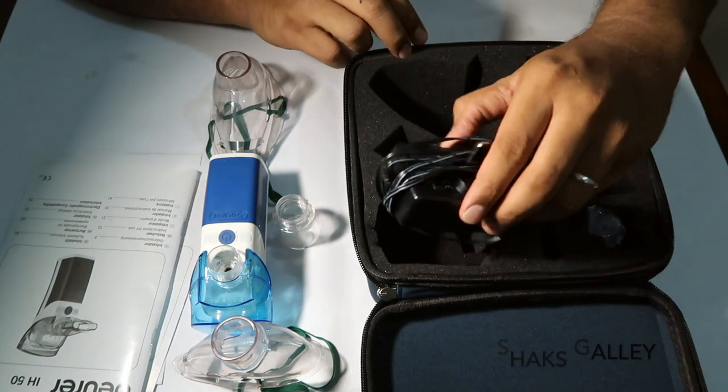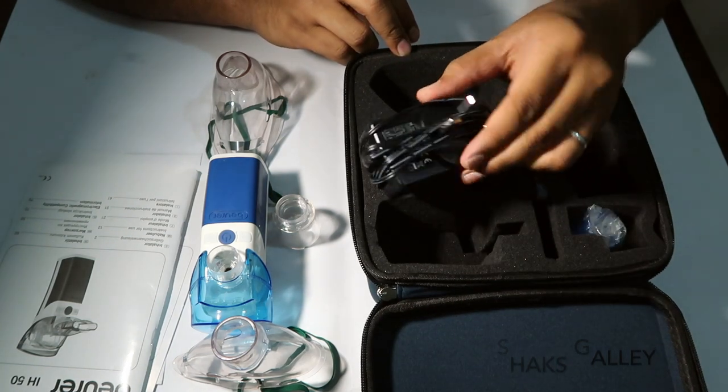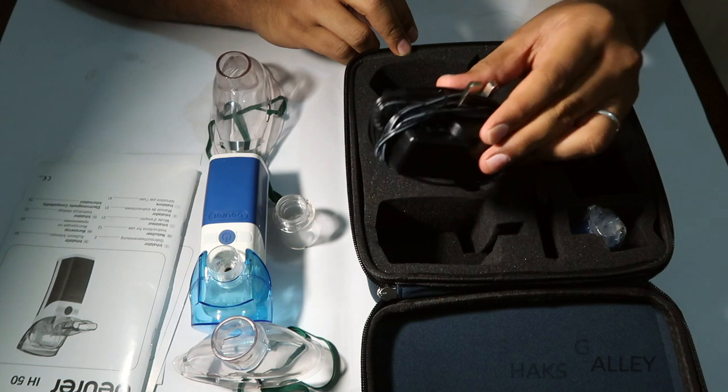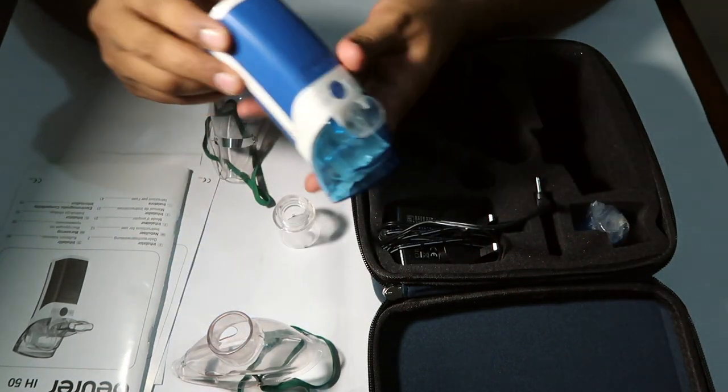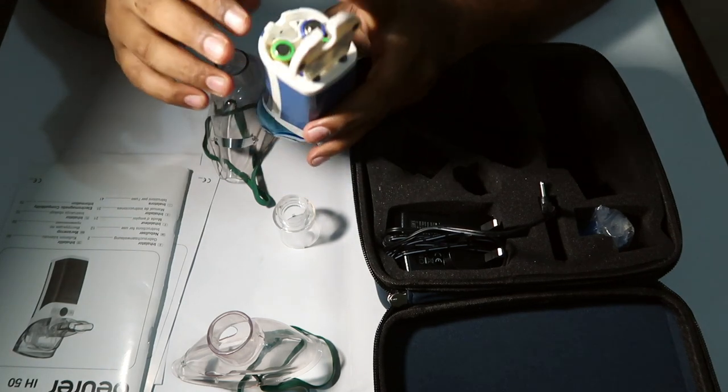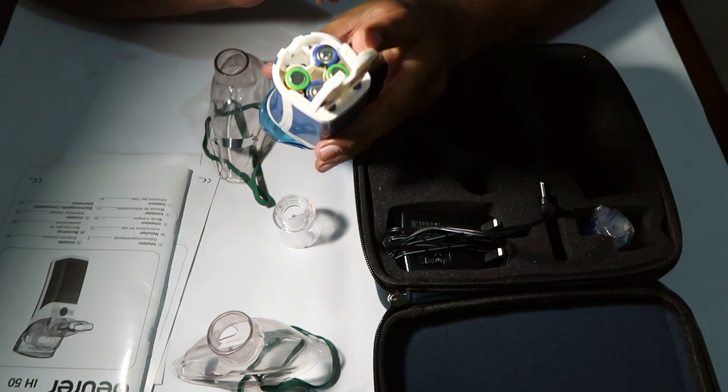This is an electronic device — you can use it with a current adapter. I have also used the battery; it is a 4-piece battery.